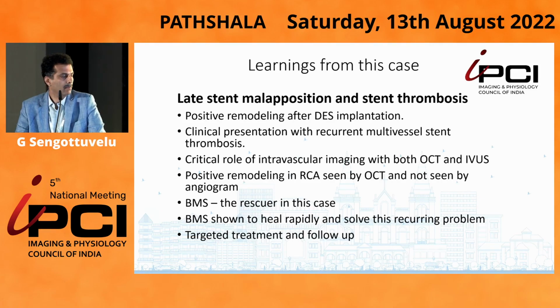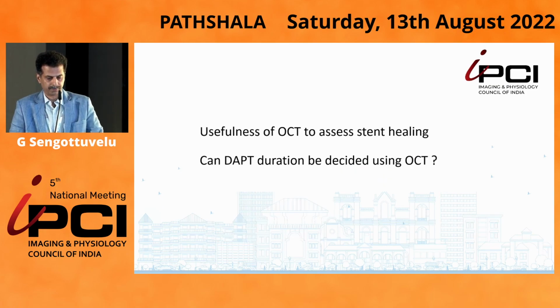I think the same question I was going to ask. Giulio, polymer versus drug. What do we think is the more biologically reactive substance? Do we know? Well, many of these patients develop this type of reaction in the mid-long term. So for the first case of the hypersensitivity, it was in Ravel. And Ravel had a serious IVUS evaluation. And at 6 months, the patient was perfectly still in terms of IVUS response. And developed this type of response 18 months later, while the drug was gone in a short period of time.